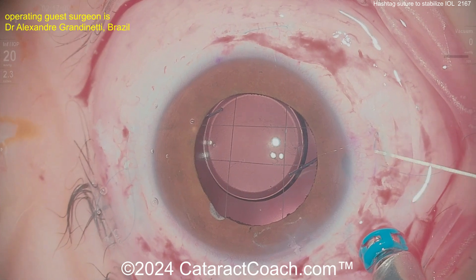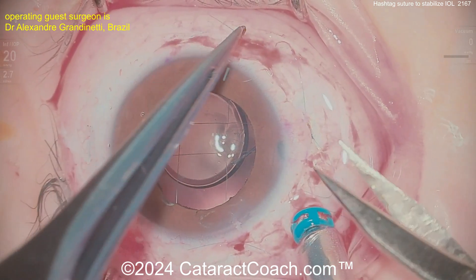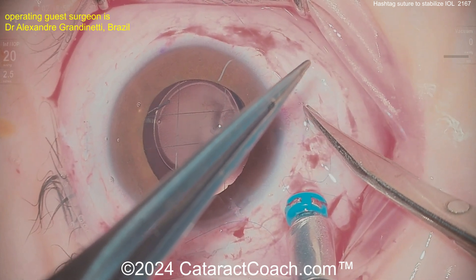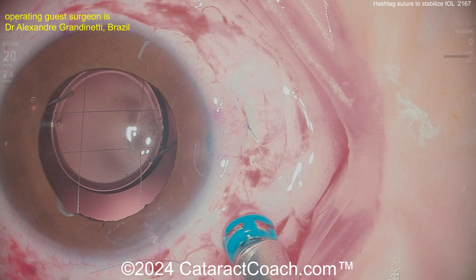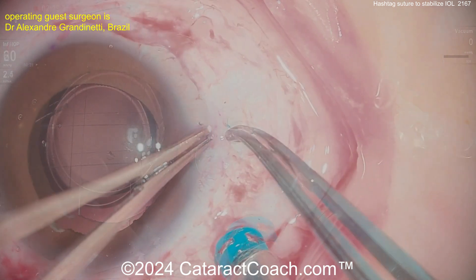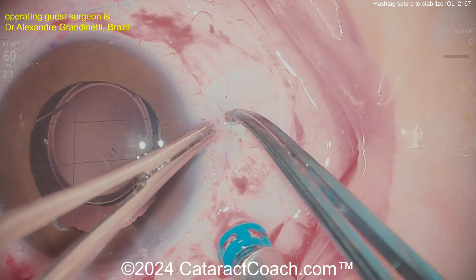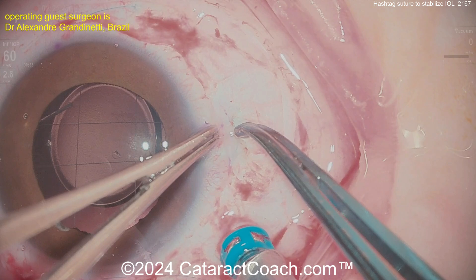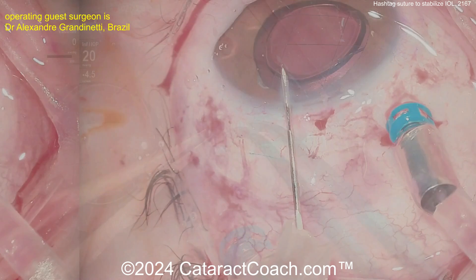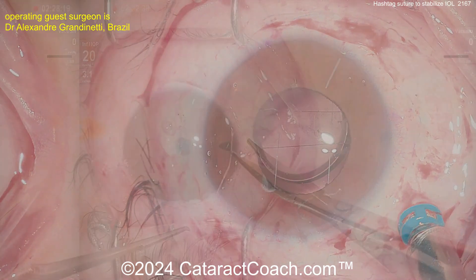Are there other options? I suppose you could think about repositioning the Yamane lens, but the Yamane lens is actually in good position with a good refractive outcome — everything was pretty good about it, except when this young person does acrobatic maneuvers, that lens optic can prolapse forward. Now with the hashtag suture in place, it is going to be secure — you won't have that optic coming in front of the iris again, solving the issue of iris capture, and that optic won't be prolapsing anteriorly anymore.